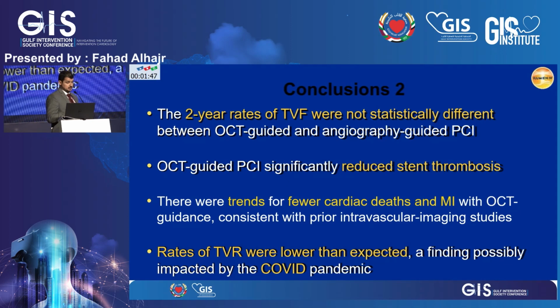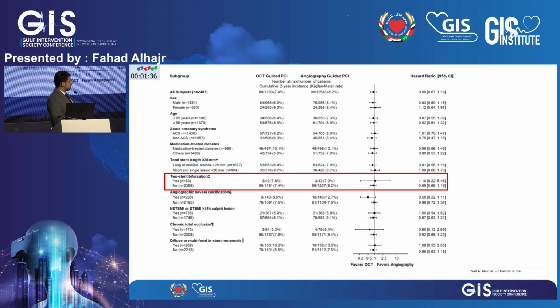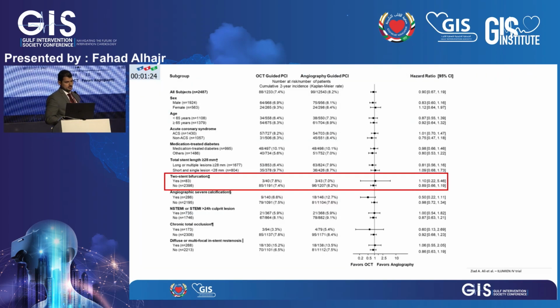There's significantly less stent thrombosis, but again, COVID impacted this trial. One thing from a subgroup analysis of the ILUMIEN: unfortunately, even the bifurcation here is negative. So the subset analysis of the bifurcation was not positive even in the ILUMIEN, which probably needs a lot more studies, and it's still 2A in the guideline.